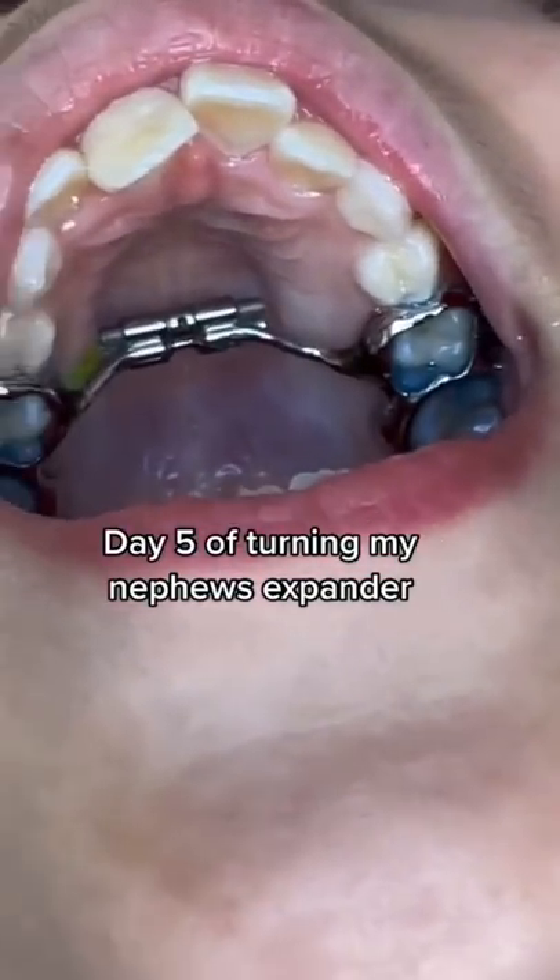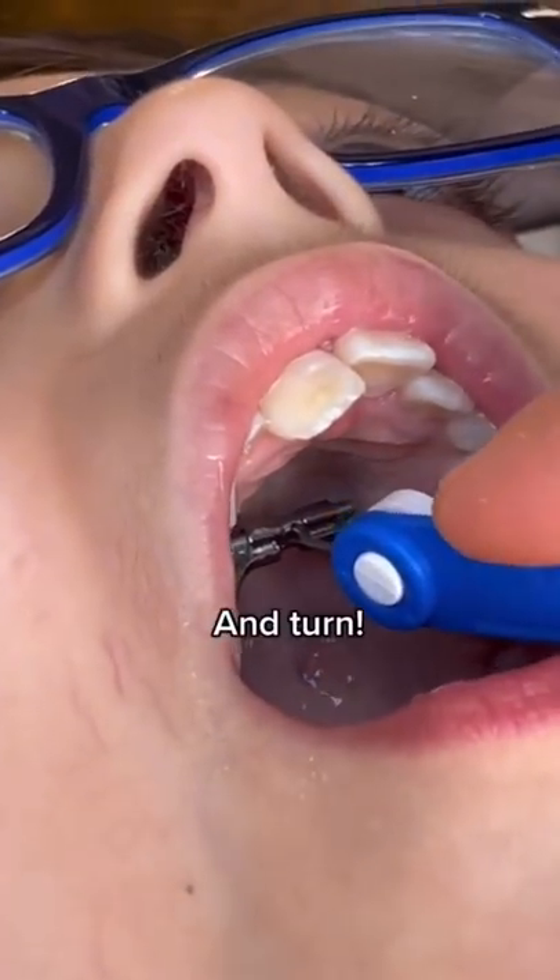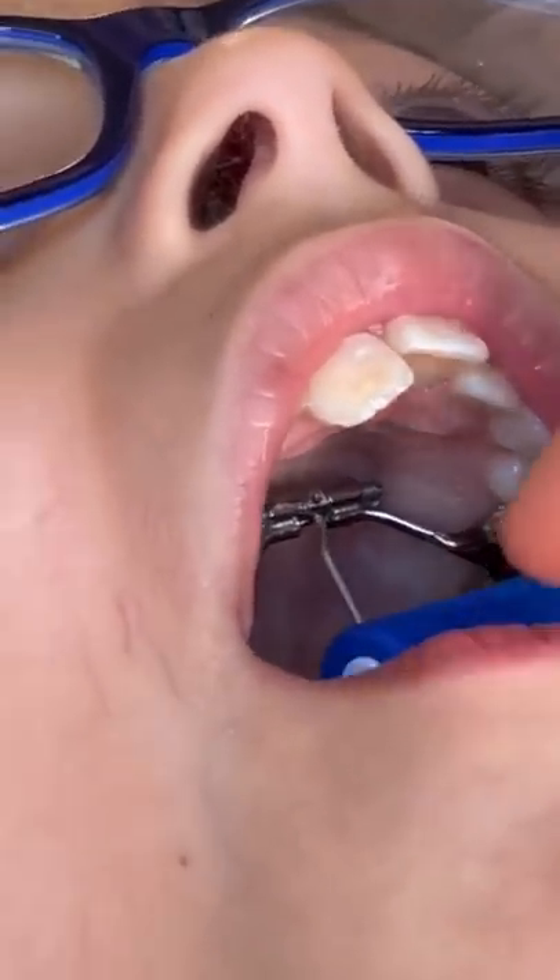Day five of turning my nephew's expander. Grab the key and turn. Keep cranking that expander wide open. For real though, expanders are a pain. So let me expand on some things that you can do to make your time in an expander better.